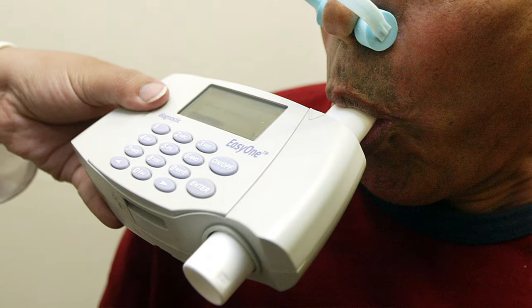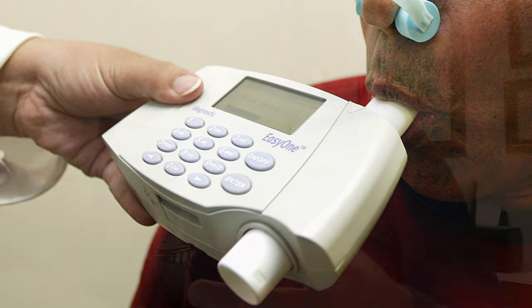If you are trying to take your health and fitness to the next level, or if you have a lung condition like asthma, or you're recovering from another sort of infection like pneumonia, then a spirometer may come in handy for you. If you've seen spirometers before, they're usually pretty big. Breathe Through is about to release the first ever portable spirometer that you can literally hold in the palm of your hand. It kind of looks a little bit like an e-cigarette. Let's take a look at how this little guy is taking the big medical machines we see in hospitals and medical centers and putting that functionality right in the comfort of your own home.